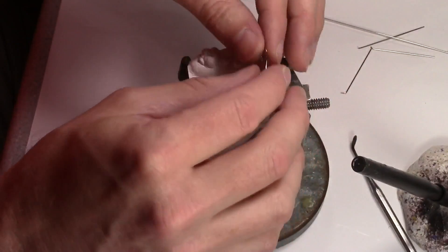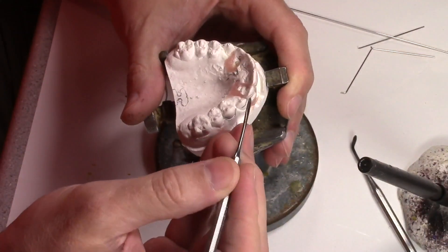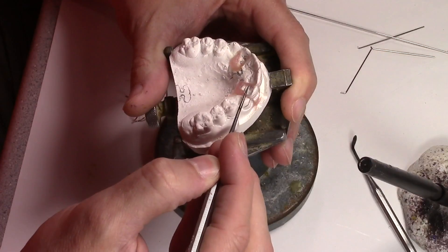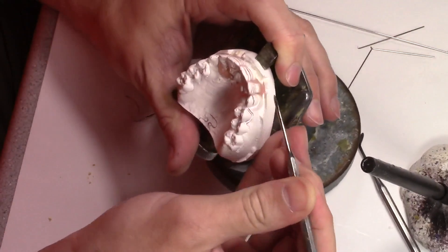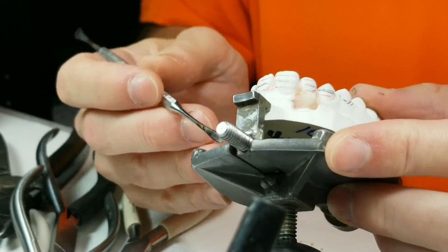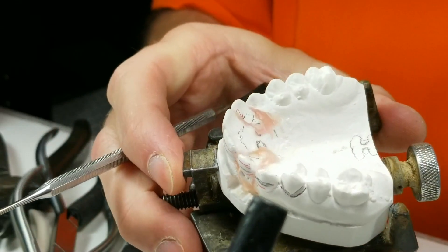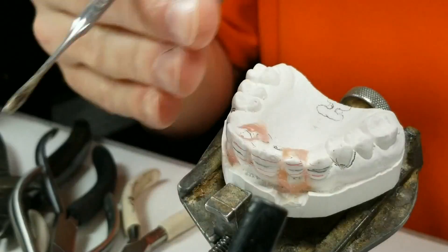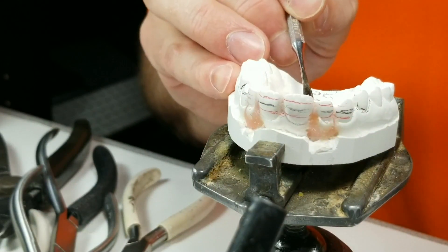So here's the model, and I've already reset the teeth. I should have taken a picture of it beforehand, but these teeth are about two or three millimeters lingual — probably about right here. You can see how much it sticks out. This one is worse than this one, but it was sticking out lingually, and I've reset them and built the gums back up with wax.